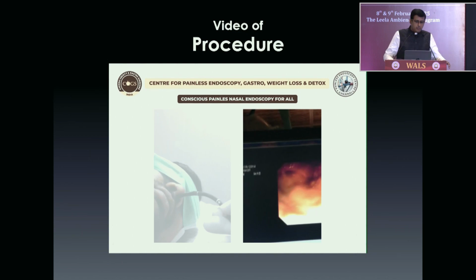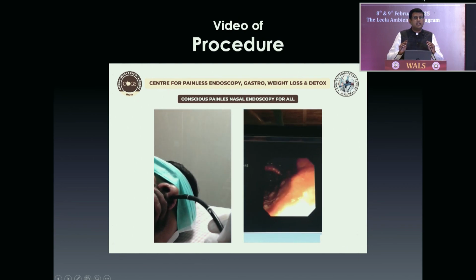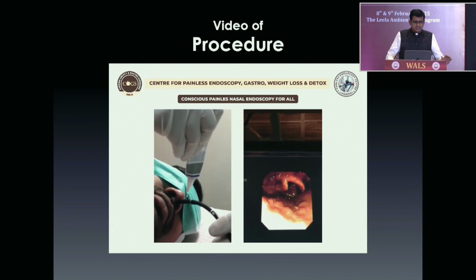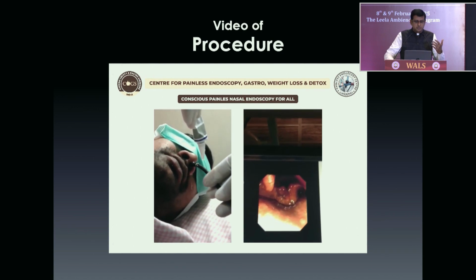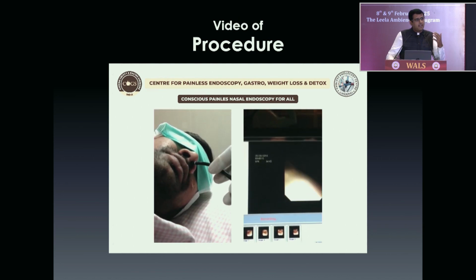Can you play this video, please? Yeah, this is the pre-operative workup for bariatric patients. Bariatric patients are always a challenge because giving IV sedation in an endoscopy suite is always a challenge. This is just to show the patient; just see the facial expression. It's the cricopharyngeal intubation that gives so much gag, so much difficulty, and the patient doesn't enjoy the procedure, I would say. But in IV sedation, it doesn't matter.